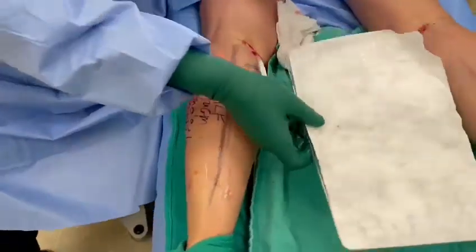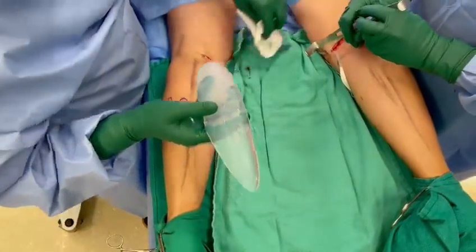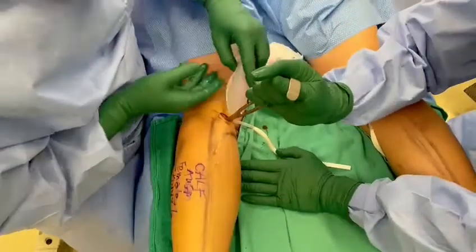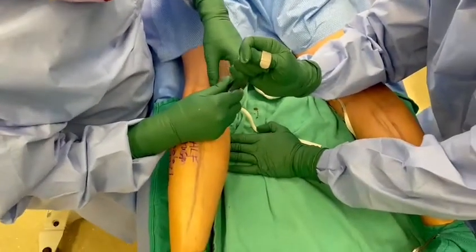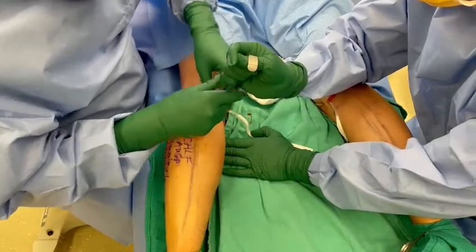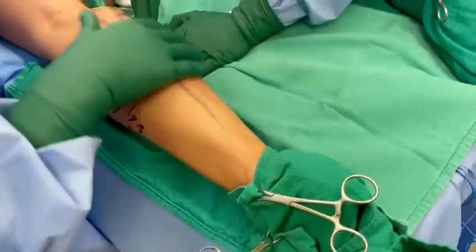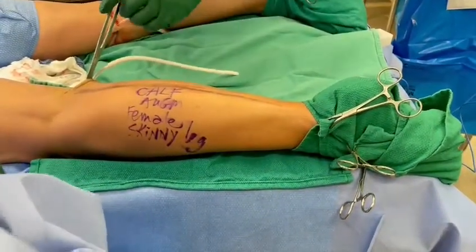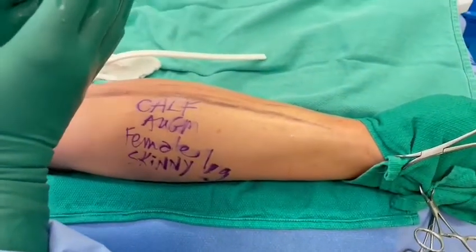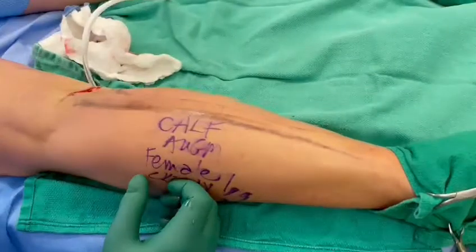Now I will show you how we put it in. It's not hard once the pocket is dissected. It's very important to be in the right plane — I see pictures online of other patients where you can see the implants because they were too superficial. We'll go gently, and I like to put it in only once, so I'll go slowly. You see the implant slowly gliding in. Now you see it goes all the way here — I can feel it all the way here. Now it is augmented. Her fascia, however, is very tight. Fascia is a very tight structure, much tighter than skin. So for a few weeks the implant will be pushed in a little bit by her own fascia, and over a month or two, as she resumes normal activities, the fascia will expand. She'll get the final result two to three months post-surgery.